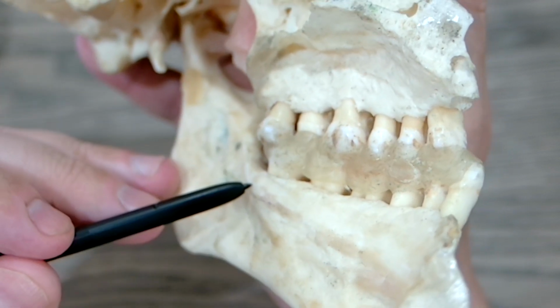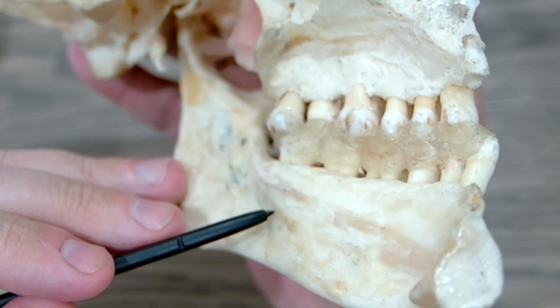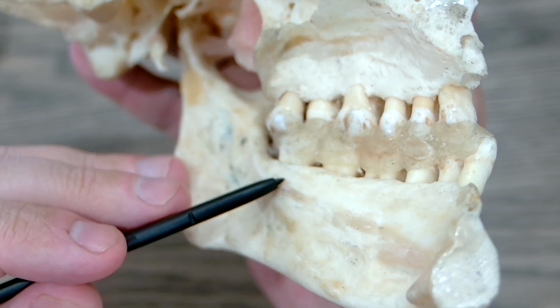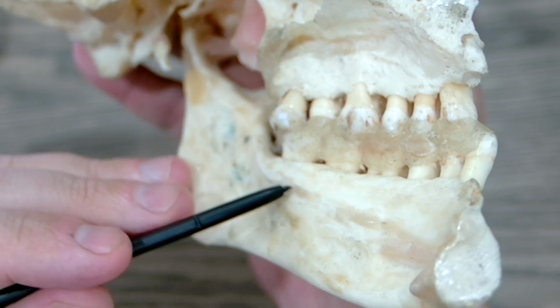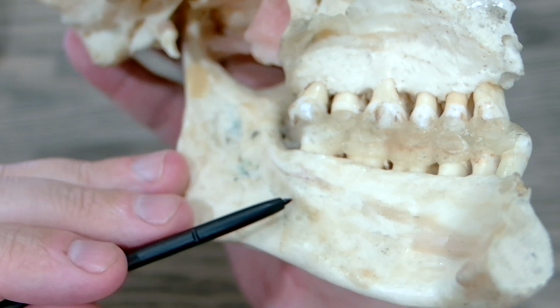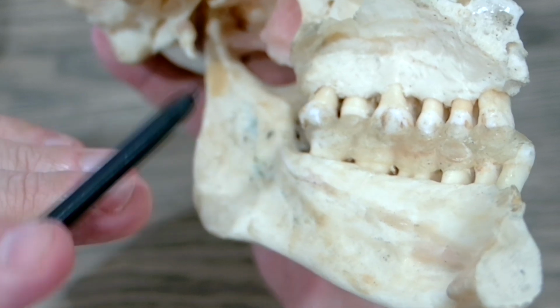So it's very important when doing implants in this region to do a full thickness flap to your anticipated depth, so that just in case you do perforate through any of this bone, if there's a very prominent lingual concavity, you won't perforate through the flap or any of those vascular or nervous tissues that are within the flap.